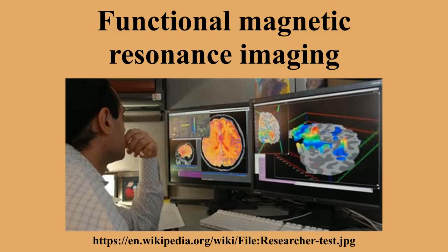Some patients may be suffering from disorders such as compulsive lying, which makes certain studies impossible. It is harder for those with clinical problems to stay still for long. Using head restraints or bite bars may injure epileptics who have a seizure inside the scanner. Bite bars may also discomfort those with dental prostheses. Despite these difficulties, fMRI has been used clinically to map functional areas.